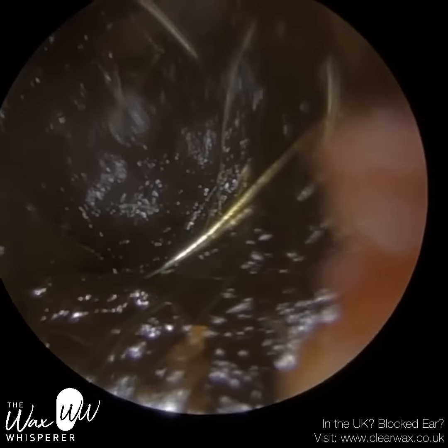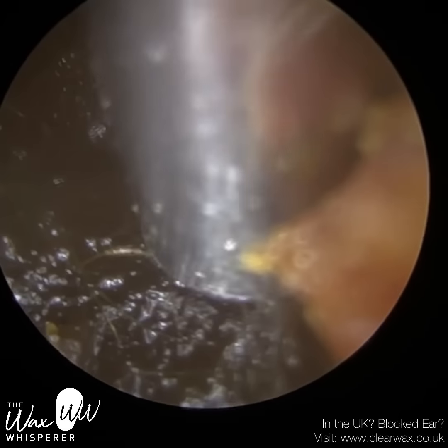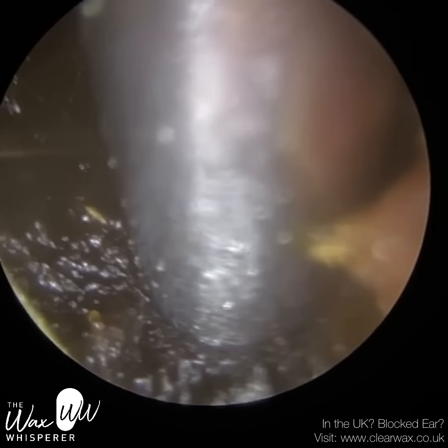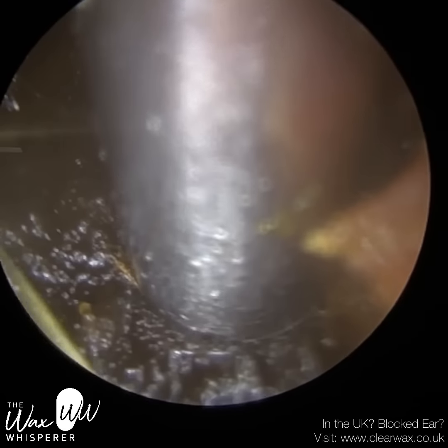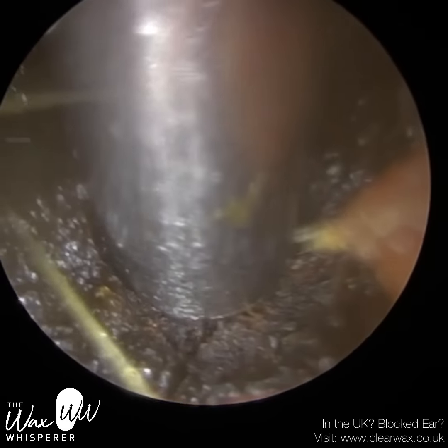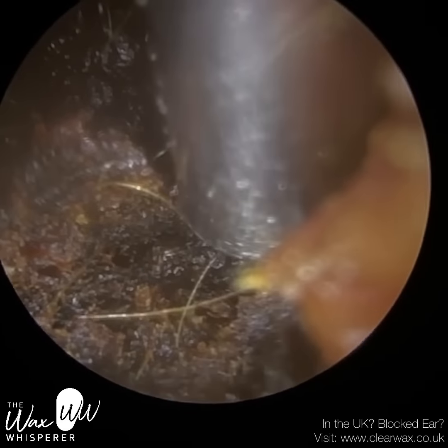I asked them whether they used anything in their ears, like a cotton bud or ear buds, and they said they didn't. But you may have seen, when I entered the ear, in the wax itself, there was a circular indentation, and to me it looked as though an object had been used, and that part of the wax was a bit more impacted as well.